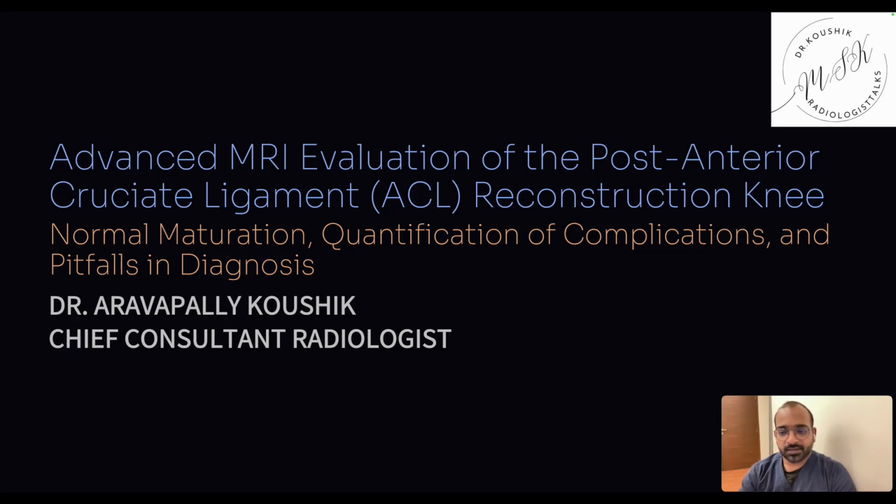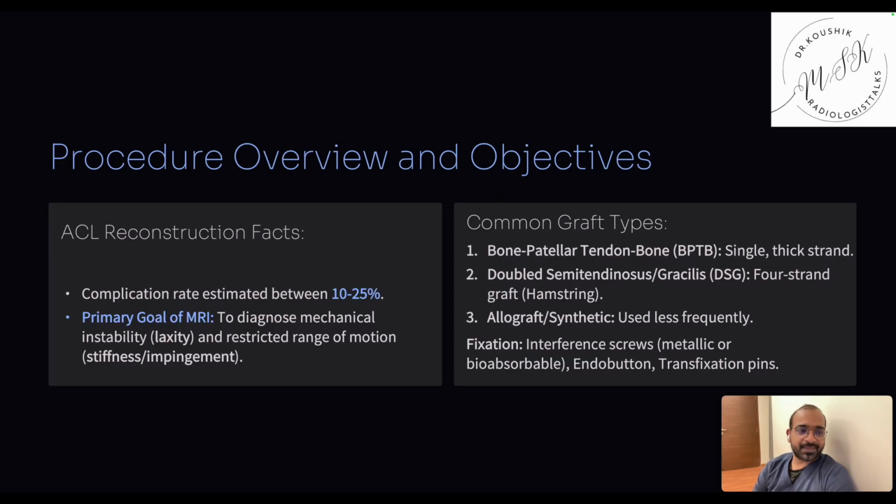Hello all. A lot of people have asked for a small session on evaluation of the post-operative knee joint, especially post-ACL reconstruction. So today's topic is MRI evaluation of the post-anterior cruciate ligament reconstruction knee. We'll see normal maturation, quantification of the complications, and pitfalls in the diagnosis. So let us do it.